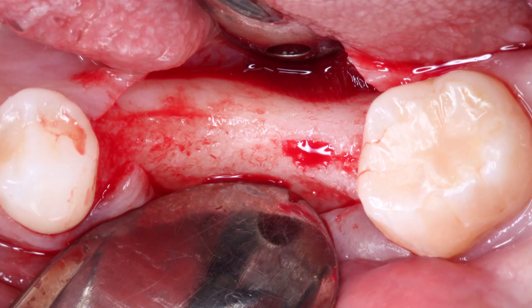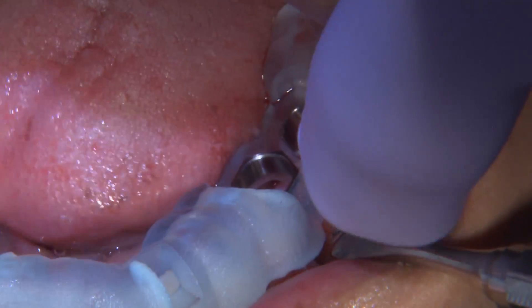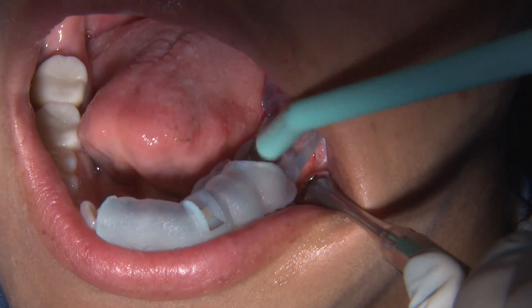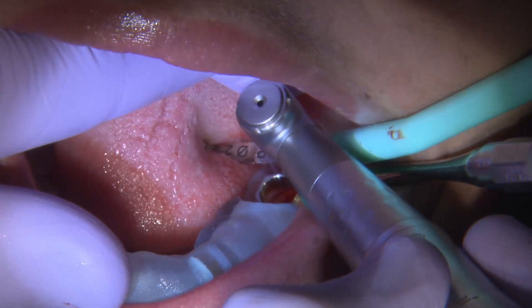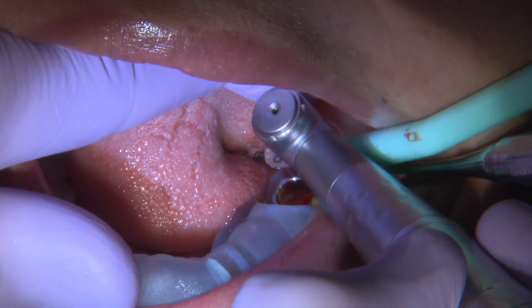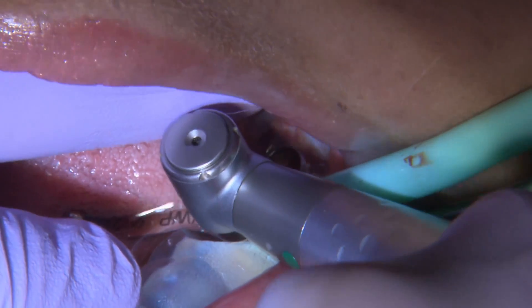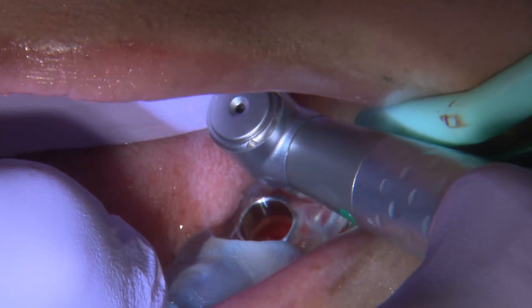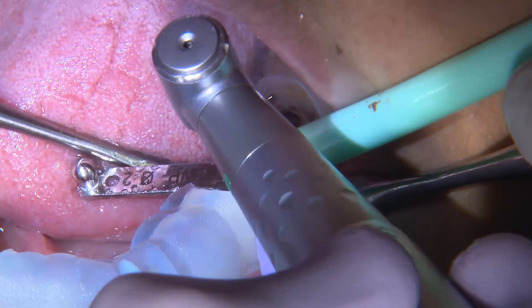Once the flap is reflected, I seat the guide — this is a tooth-supported guide — which gives great stability, and I can go through the drilling sequence, create the osteotomy, and place the implants through the surgical guide. Each step is very important, and the most critical thing is to stabilize the guide and make sure it is not moving while going through the osteotomy drills.